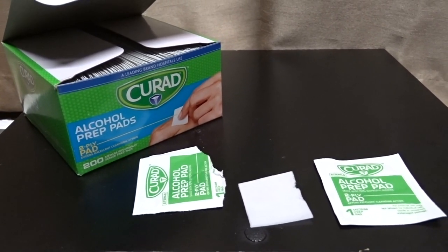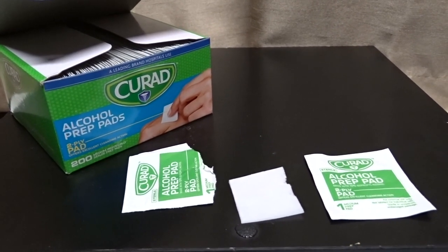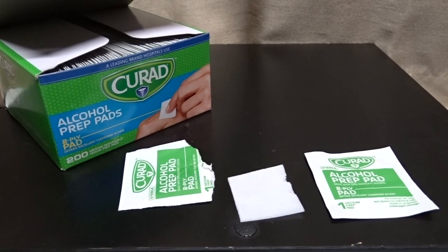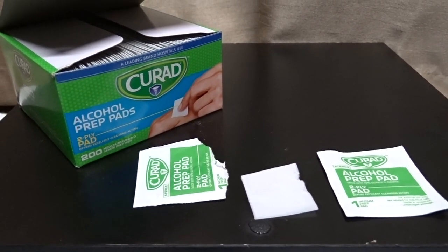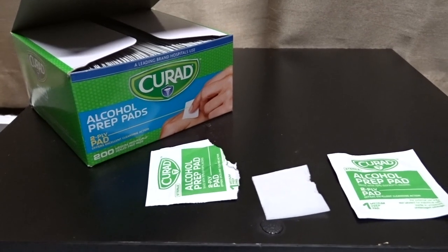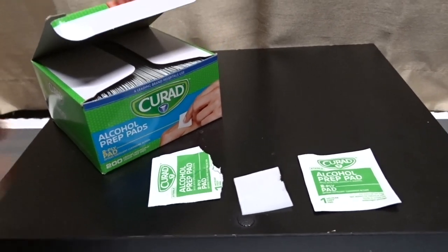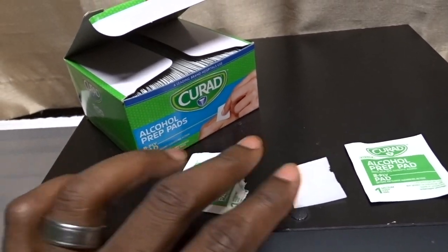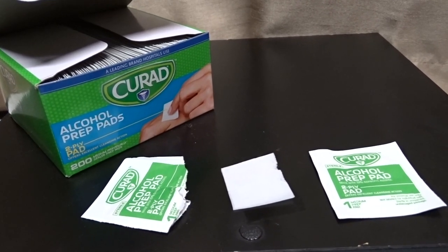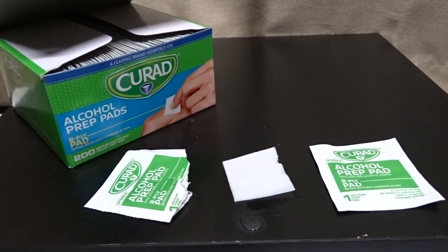Once I found Curad, I didn't go back to anything else. I did have an experience with a previous brand that was not saturated enough — it felt dried up, as if the sealed bag had been opened and the alcohol evaporated. Curad pads are never like that; they disinfect really well and I like them a lot.